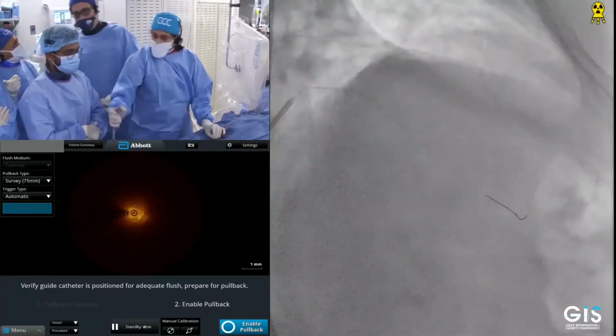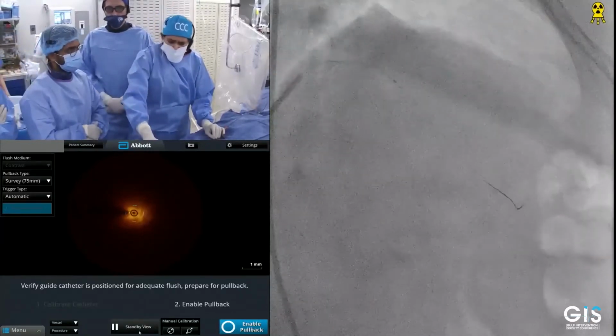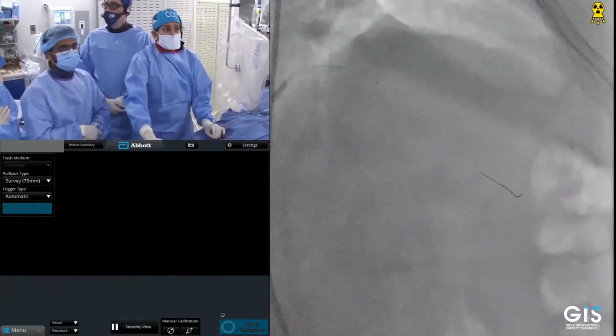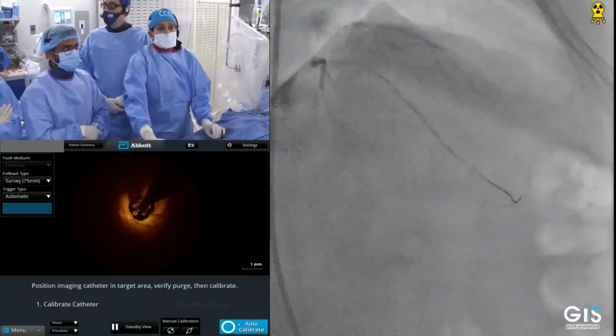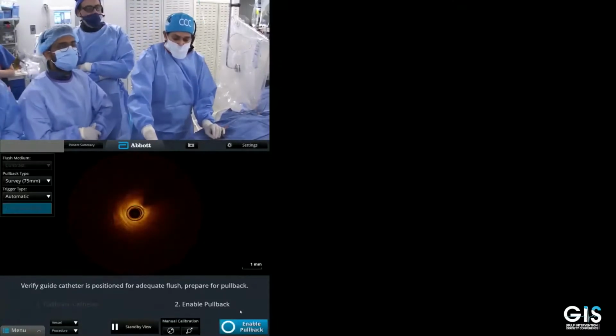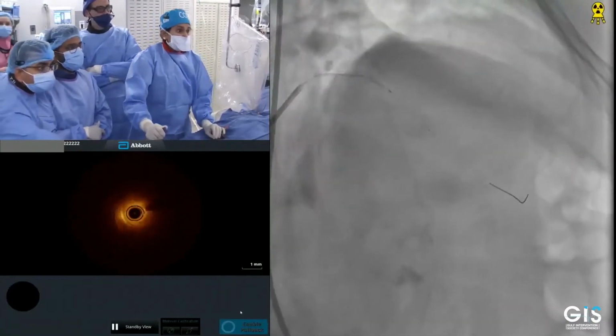Thank you, I think it's very interesting, but just one thing: this is a moderate lesion to me, so I think having a positive iFR will work on to the imaging for sure, because it sounded like a very calcified lesion and may need atherectomy for this lesion.